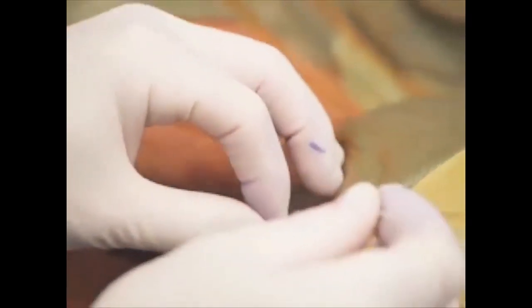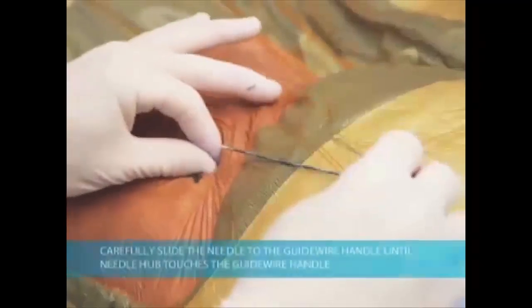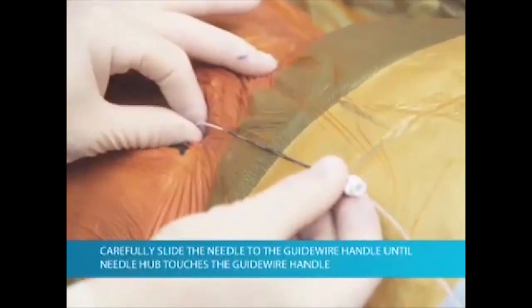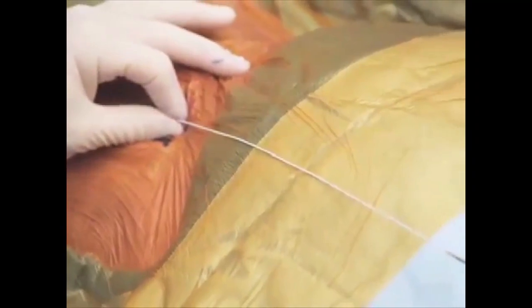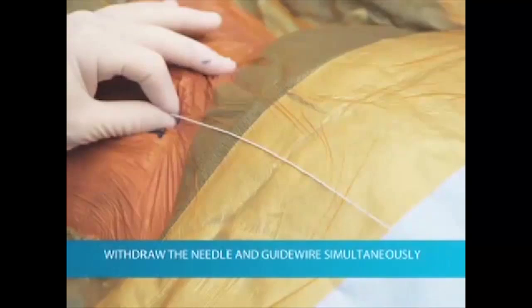Carefully remove the needle from the fascia. Then, grasp the catheter near the exit site, and carefully slide the needle to the guide wire handle until the needle hub touches the guide wire handle. While still holding the catheter securely at the fascia exit site, slowly withdraw the needle and guide wire simultaneously. This prevents the needle tip from damaging the catheter during guide wire removal.